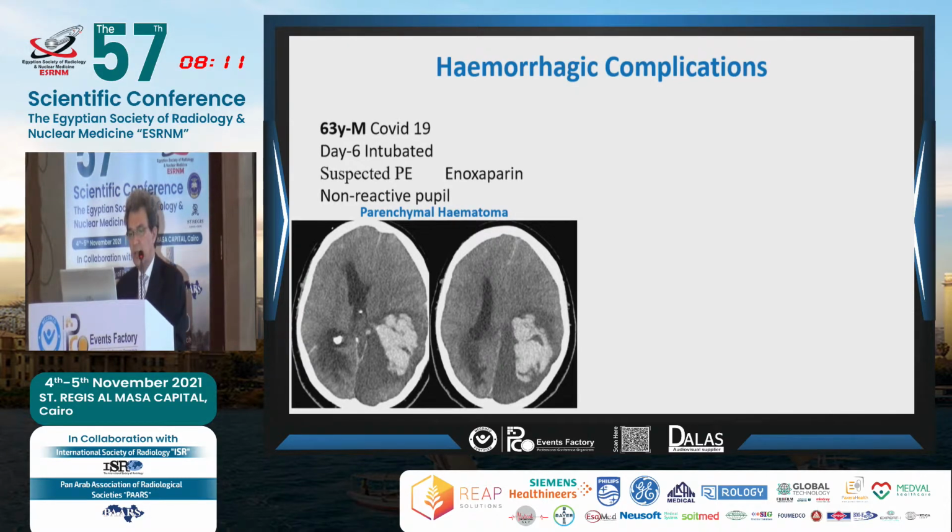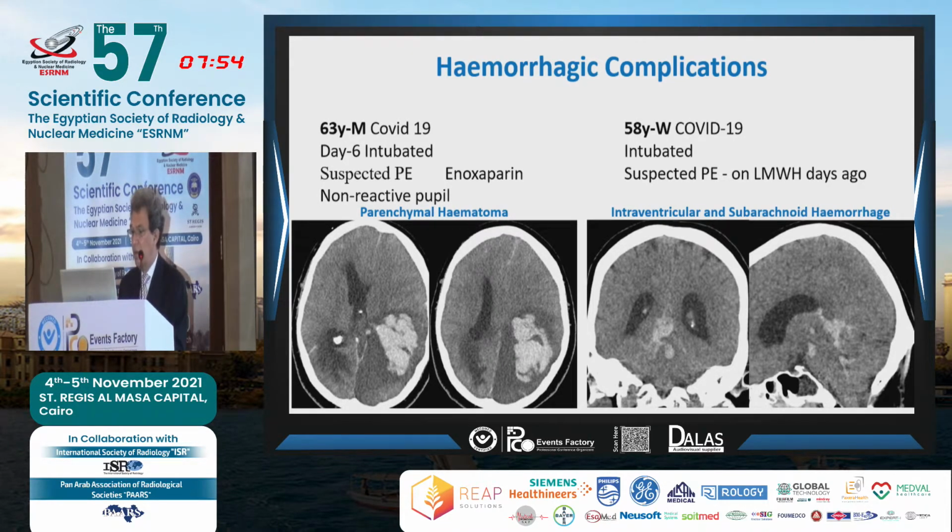So in this patient, 63-year-old, was intubated on day 6 with a suspected PE, and the pupil was non-reactive, and you see why. It's a massive hemorrhage with a clear midline shift, effacement of the sulci, and obviously a bad outcome.